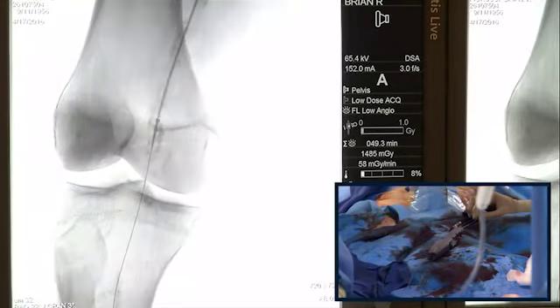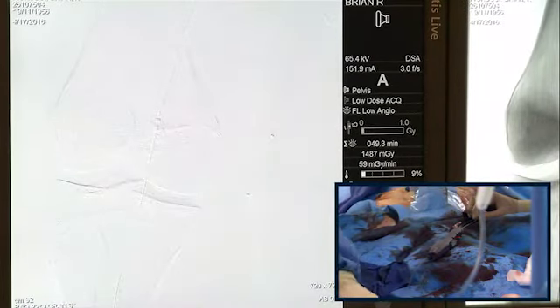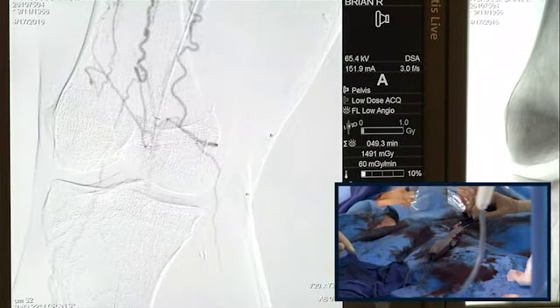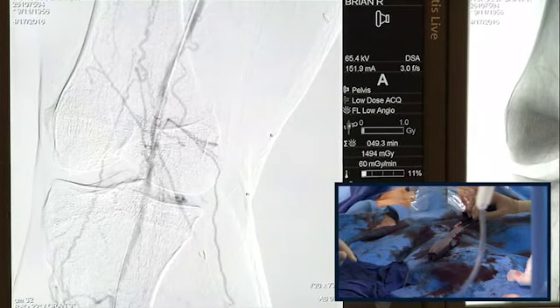The 15 is hard to control. Yeah, I am going to try, let's see here. Let me take a picture here. I may have to put 2 Superas, to be honest with you. My own experience has been that with this kind of situation, where the lesion doesn't give and is heavily calcified, using the longer Supera is a little bit more challenging. Now, it just could be my experience. Maybe I don't use it as much.